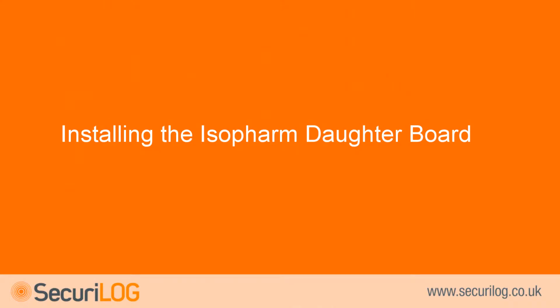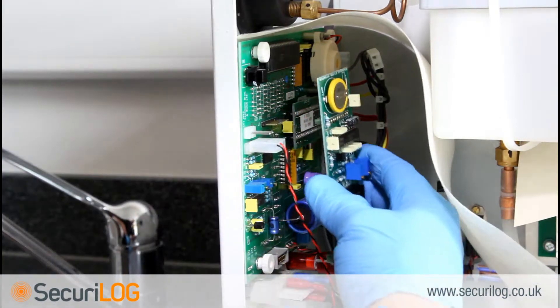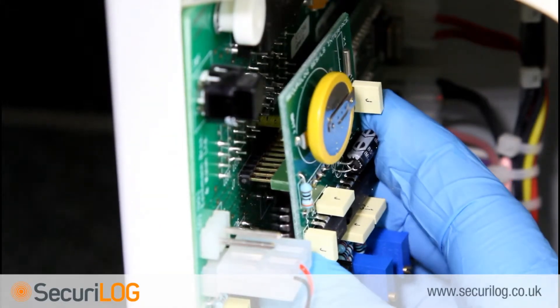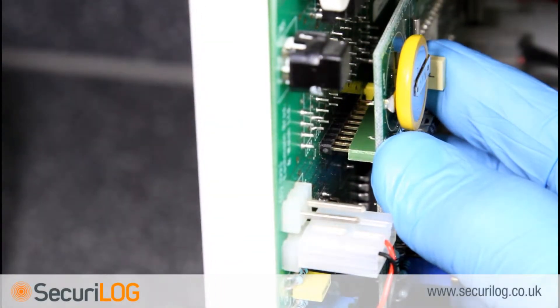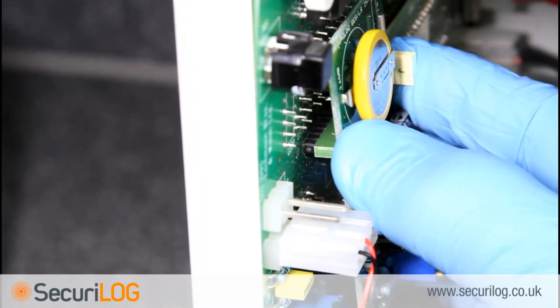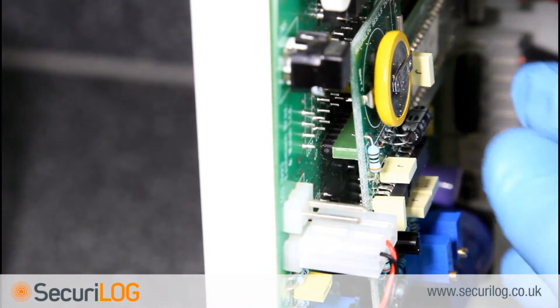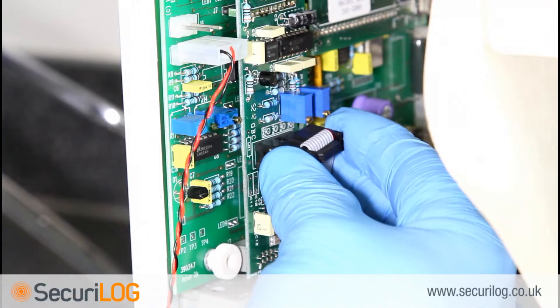Installing the Isopharm daughterboard: this part of the installation is only required if the steriliser does not already have a daughterboard installed. Fit the Isopharm daughterboard onto the main PCB. Take care to ensure that the 10-pin connector at the top is connected to all 10 pins on the main board, as this is easily misplaced. Once inserted, plug in the Securilog ribbon cable.